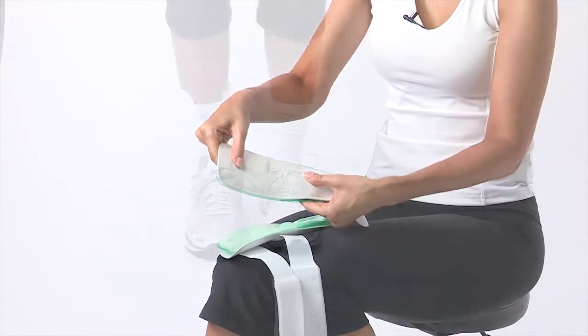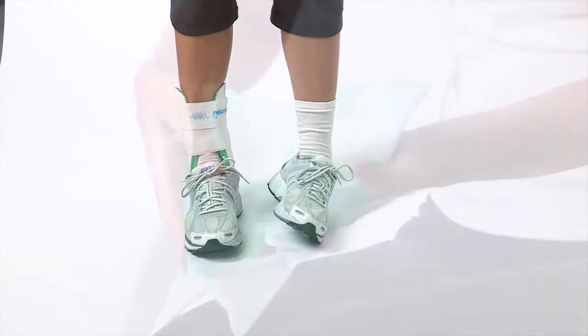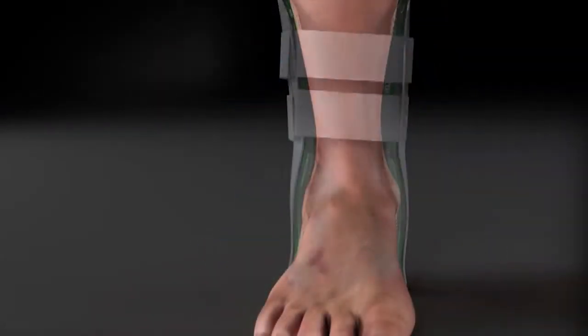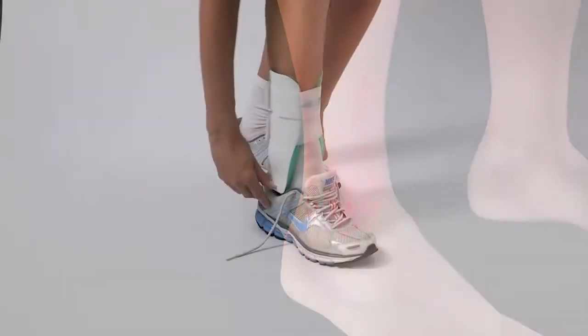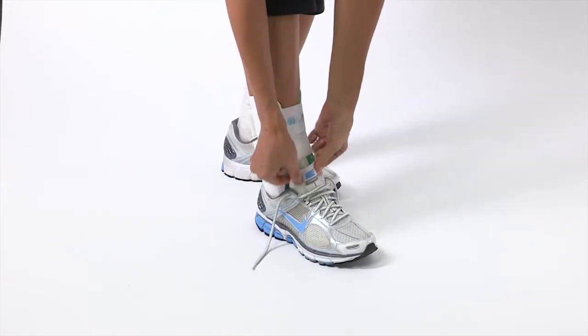Here's how it works. The semi-rigid anatomically designed shells provide support and help prevent rollover. The two pre-inflated air cells inside provide pulsating comfort as they work together to reduce swelling and increase circulation. With its streamlined design, the Aircast Air Stirrup fits comfortably in most shoes.